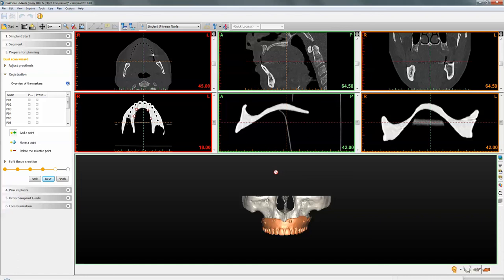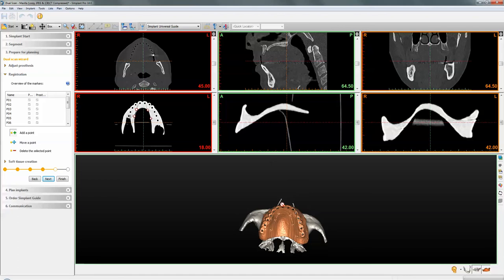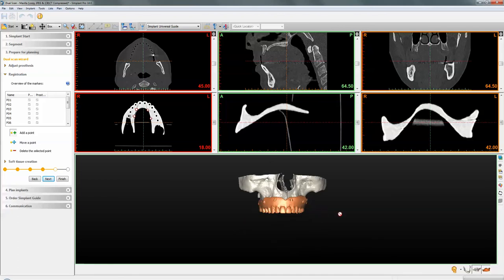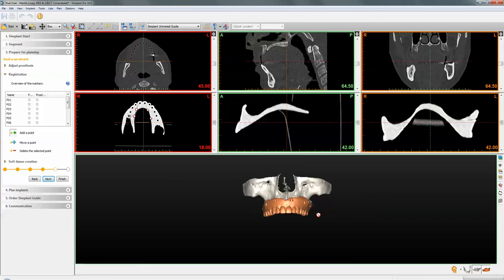Our beads are glass beads, so they will not affect the aesthetics of the denture. You can embed them within the denture and no one would notice them. By having the dentures in place in both scans with symmetrical beads attached, there is very little to do in the implant software when merging the two files together.